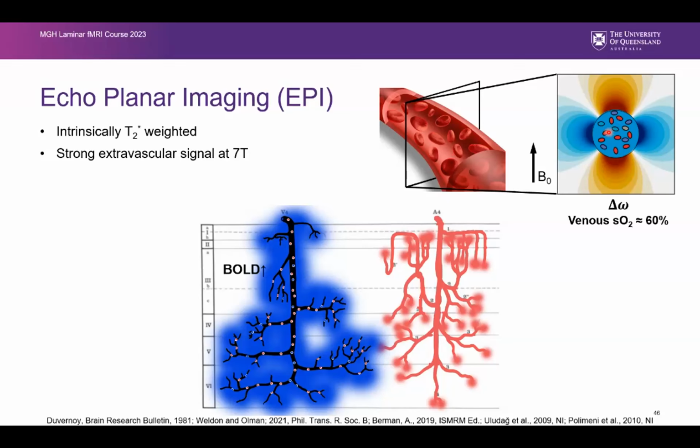But they are caused by the deoxygenated hemoglobin inside the vessel. So the signal originates in the vessel, in the sense that's where the deoxygenated blood is, but you measure its effect on the voxels that are extravascular, so outside of the vessel. That already tells you that this contrast is probably a little bit less specific than the rest, because the deoxygenated blood is not just in the vessel, but it actually affects what's going on around it.